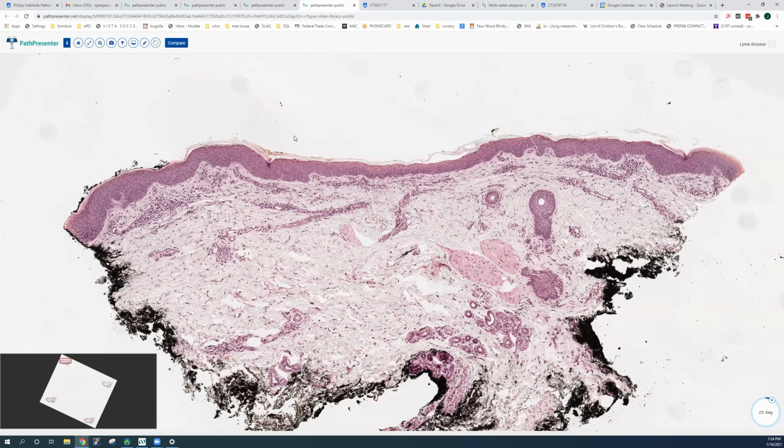And actually, not only do we not see it in Oregon very much, but even on the East Coast in the Eastern US, where it's seen a lot more, it's rarely biopsied because the histology is so nonspecific. And as you probably know, the diagnosis is mainly made on clinical grounds, and it's often treated empirically without biopsy. So, but here, let's go and look at this ECM example.